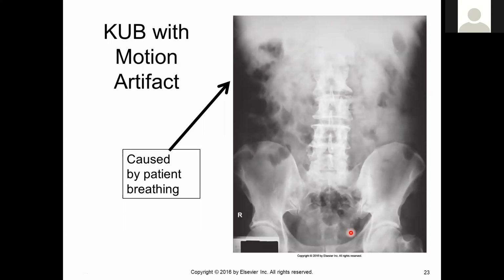You can see bladder contents here. The patient has a full bladder. And we have part of the pubic symphysis visible, not all of it, that's fine. We don't need all of it. We just need to see that separation, even just a glimmer of it. But if that's clipped off, then you need to do a supplemental picture.